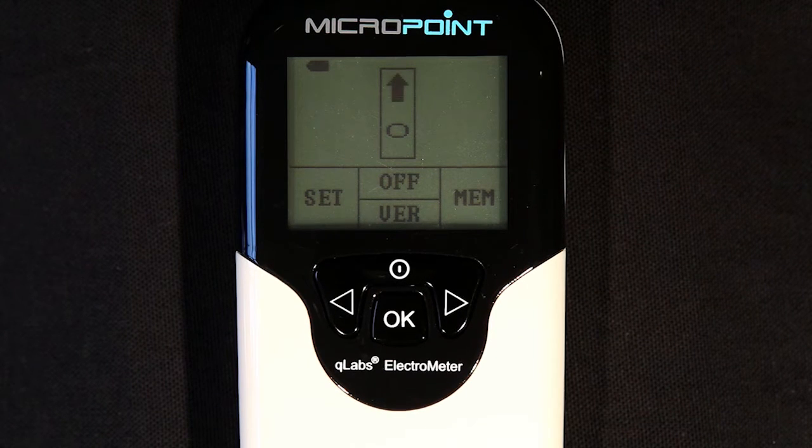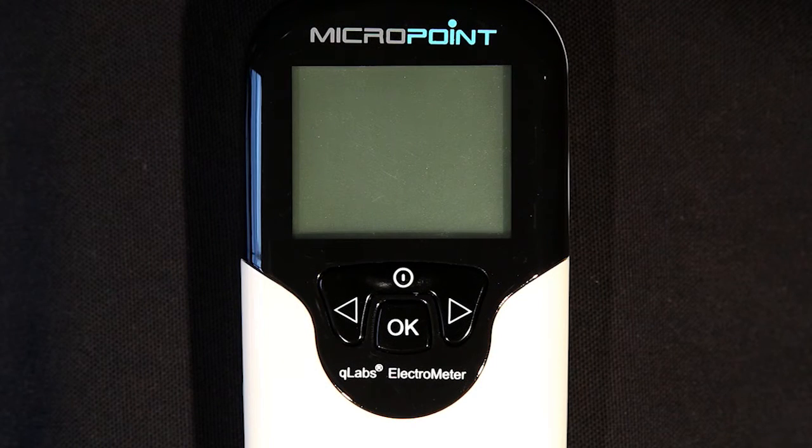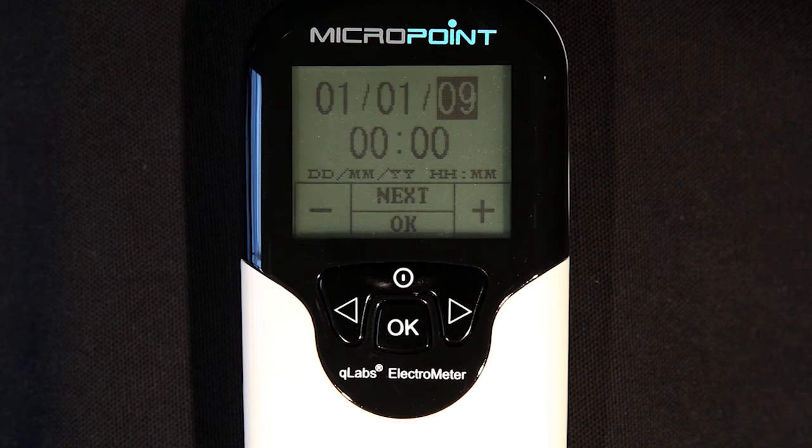If the Q-Labs Electrometer is left idle for about 5 minutes, the unit will turn off automatically and enter standby mode. When in standby mode, you can power on the monitor by pressing the power button, or insert a fresh test strip if you are ready to perform a test.